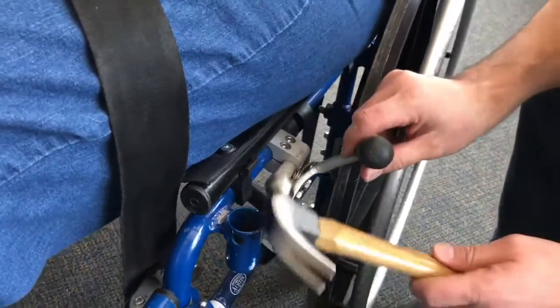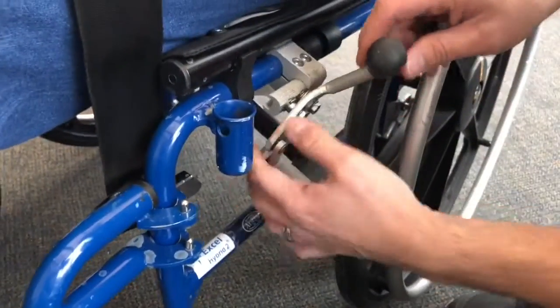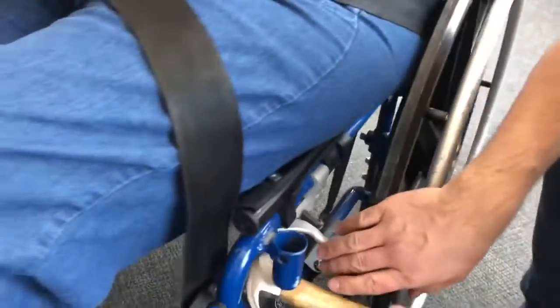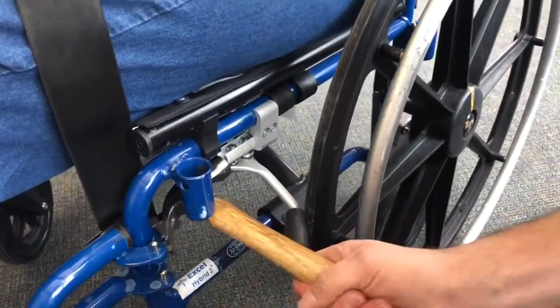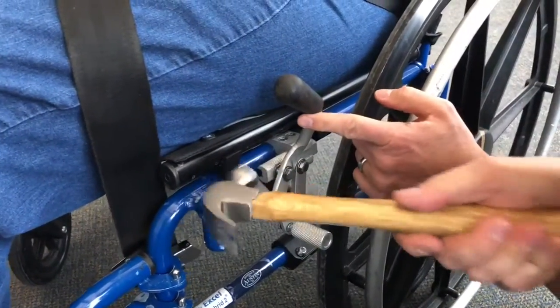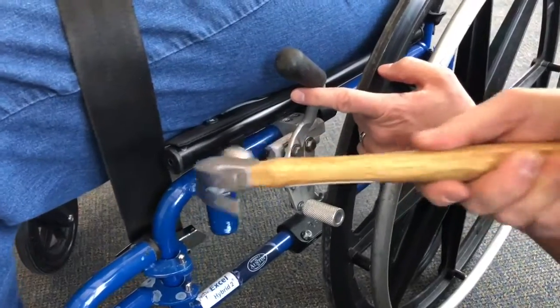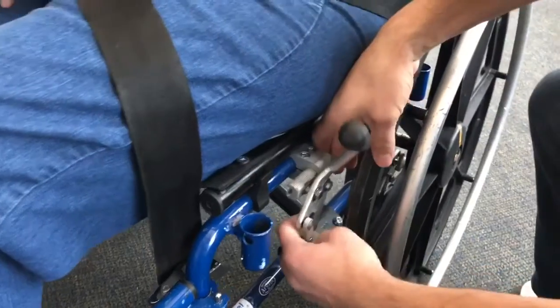So what I'm going to do is take the hammer and just bump this whole mechanism forward. So you see this is going to slide inside and get this brake just a little bit closer to the wheel. And that's really what I'm going to want. So I'm just going to pop this forward just a little bit. I'll just bump it forward. There we go. Now I'll pop this back out.